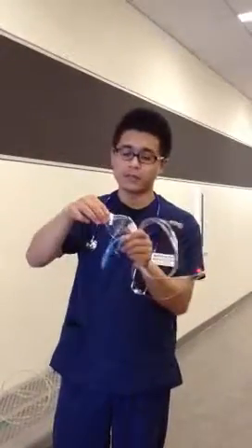Okay? Now, the different application with this is it's a mask. So you're going to place it around the patient, make sure the band has at least 2 fingers space, make sure you don't snap the patient, and make sure you pinch the metal part. And you ask the patient, does that feel comfortable? If not, readjust. Make sure you troubleshoot anything.